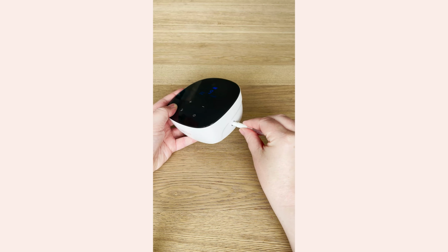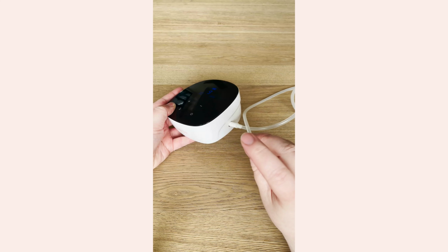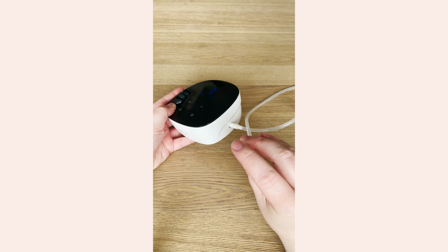Pop the tubing into the unit and place your finger over the end. You should still be able to feel the suction working. If not, replace your tubing and connectors.